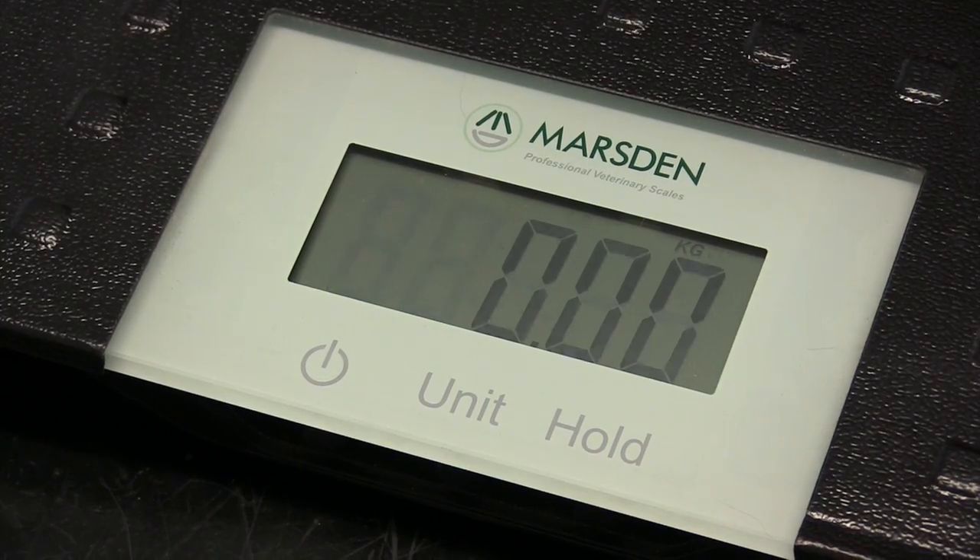The V100 also comes with an auto shut-off to save your batteries. Once you finish weighing your pet, the scale has an easily wiped down surface. The V100 — tried and tested in North Yorkshire.